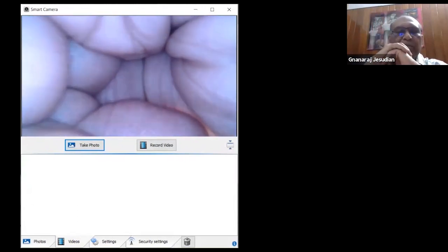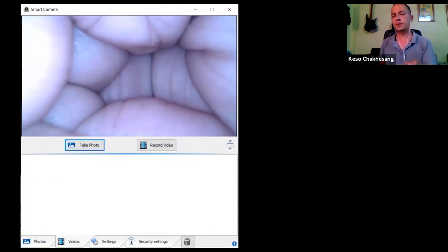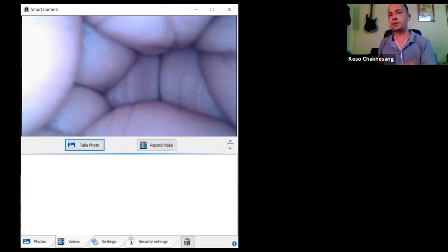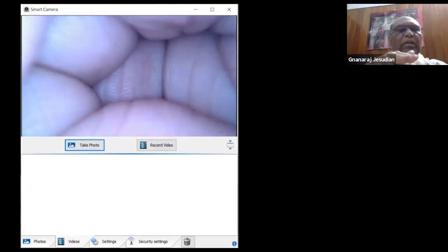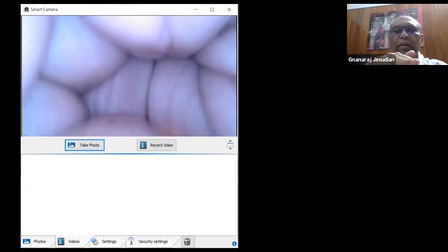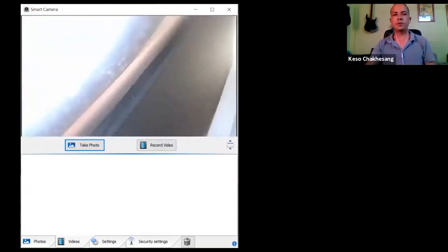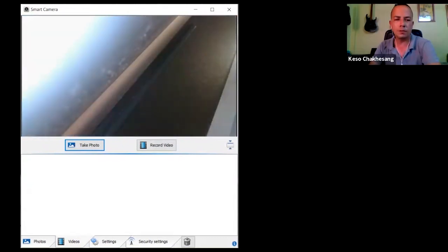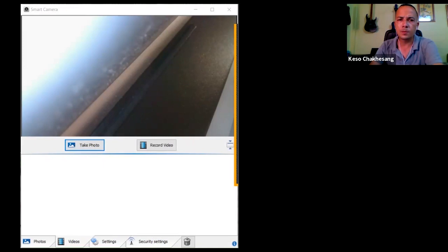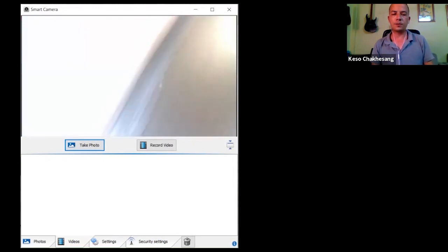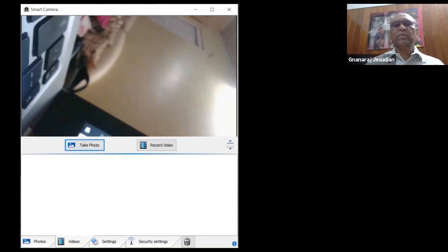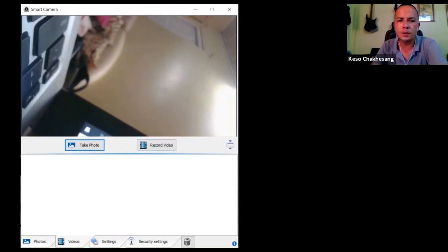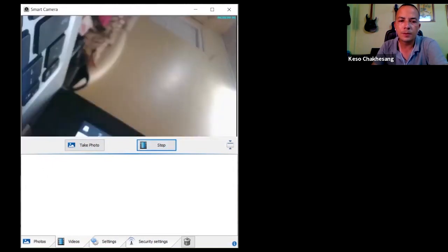If anybody wants to have the cystoscope, then we can include recording facilities. If you can see my screen, you can take a photo, you can take still photos. You can record video. And you have the settings over here. So you can change the settings. It's called Super Eyes, this is the name of the device. And then for the video format, there's a range of formats. So I prefer to use the default and not get stuck with other things. The recording method is AVI, which is one of the common recording interfaces. And the other things, maybe you don't need to. You can even specify the path where you would like to save your videos.